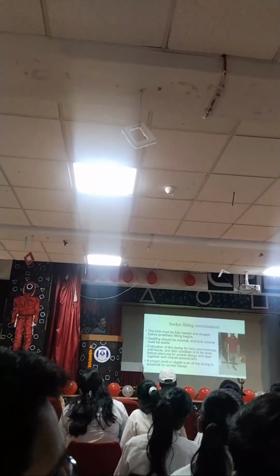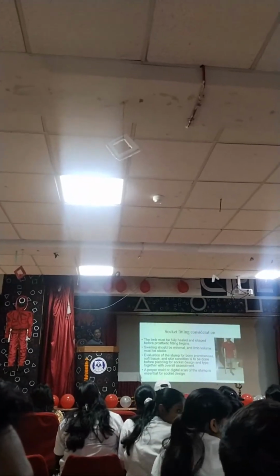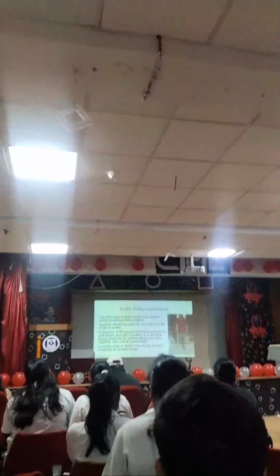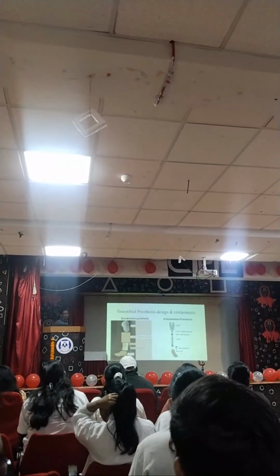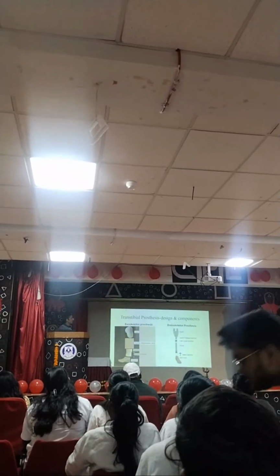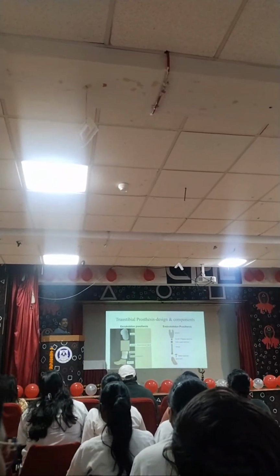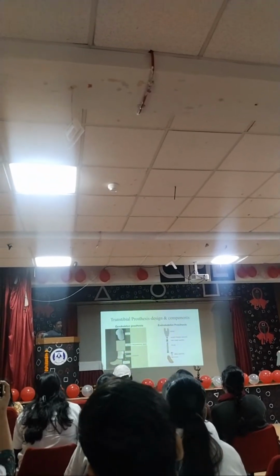After getting this information on the stump, after evaluating the stump, we go for either casting or digital scanning, so as to get a replica of the stump, either as a soft copy or as a hard physical copy. So what do we in general know as a prosthesis? When we say transtibial prosthesis, the overall prosthesis design in the transtibial could be exoskeleton or endoskeleton.